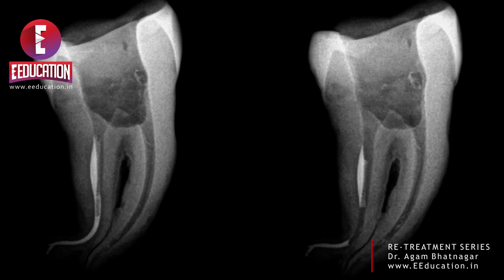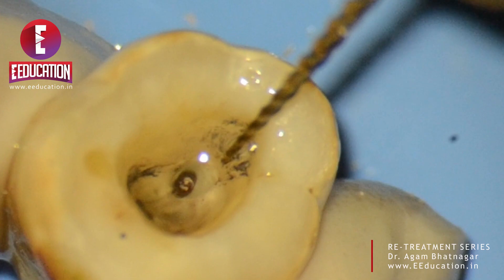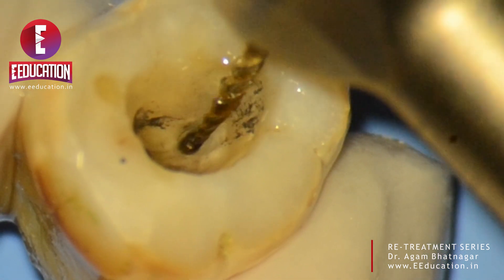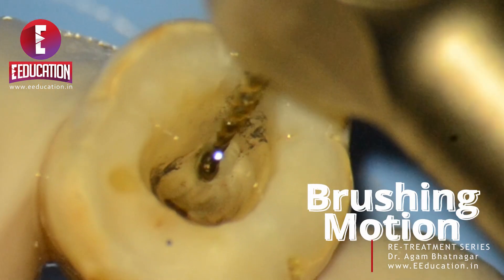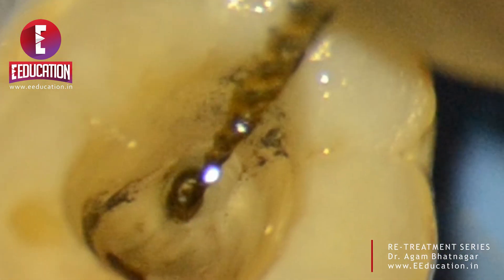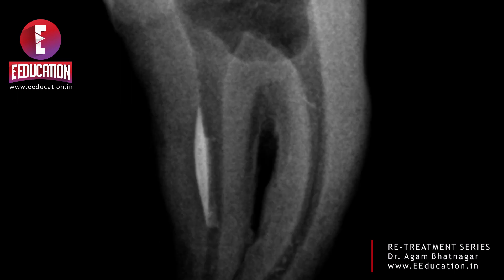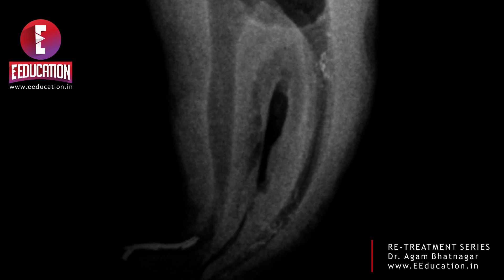Comparing the two IOPAs — especially in wider canals, you will notice that some gutta percha remains in the dilated portion and does not come out with the HyFlex Remover. In such situations, the metallurgy of the HyFlex Remover allows an additional movement: a brushing motion against the wall as you withdraw the file, which removes gutta percha adherent to the walls. The subsequent series of X-rays shows the different stages of removal. Finally, the entire canal was cleared — we removed all gutta percha down to the apical third, a few millimeters short of working length, with absolute ease.